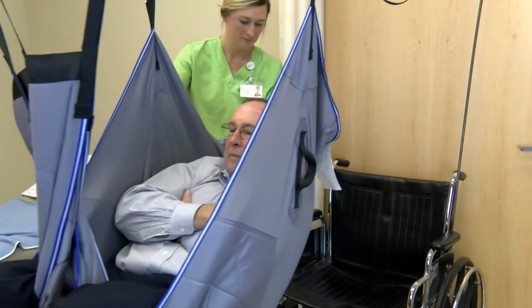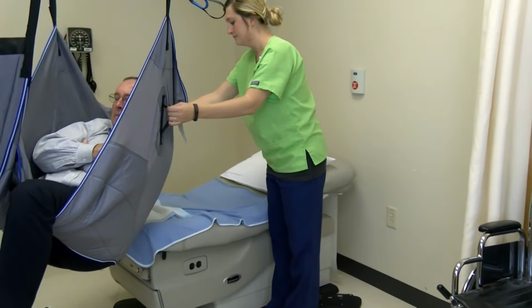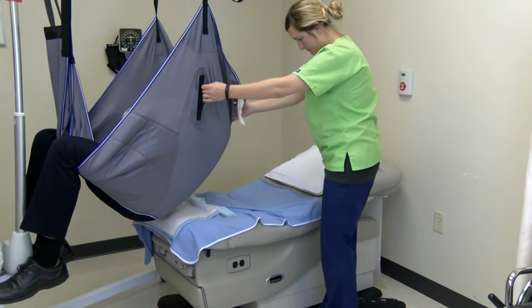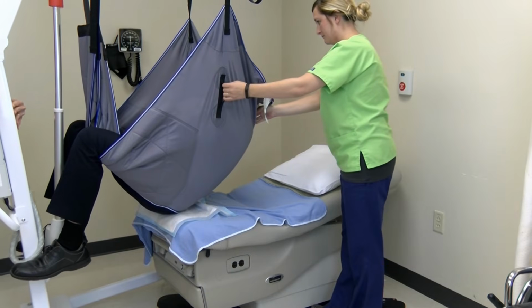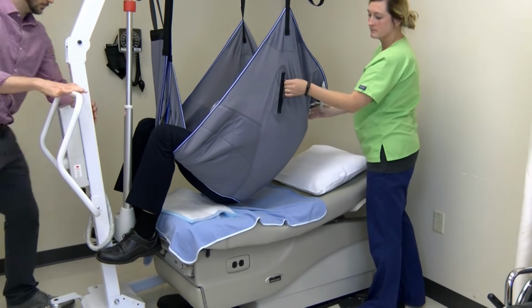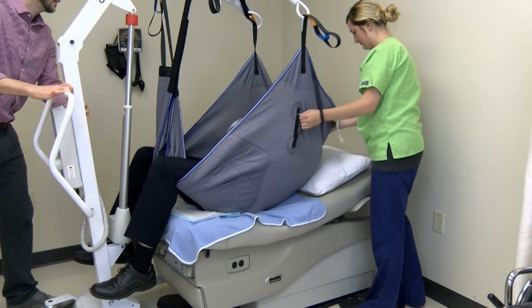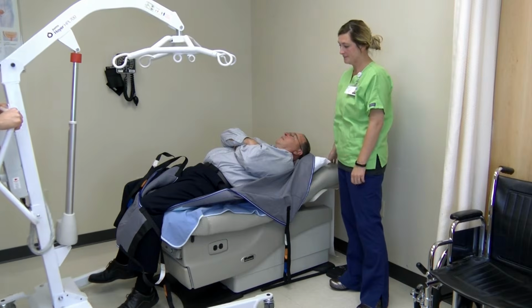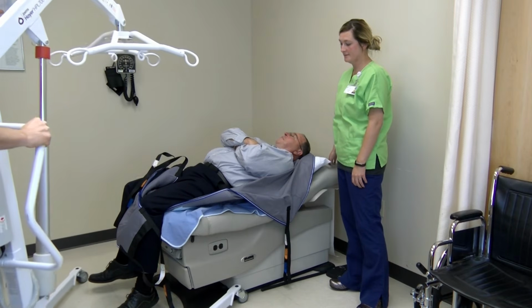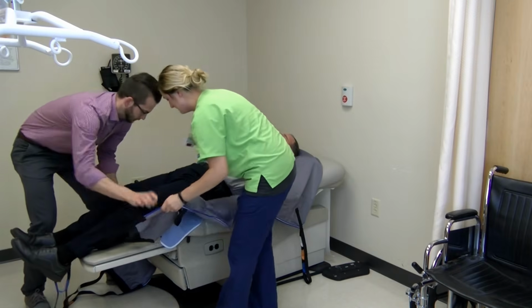Gently turn the lift toward the table and position the patient over the middle of the table. Rotate and properly position the patient over the bed. Lower the patient on the table. Once the patient's full weight is on the table, you may lock the casters again and remove the straps from the lift. Unlock the rear casters and remove the lift. Remove the sling from underneath the patient.